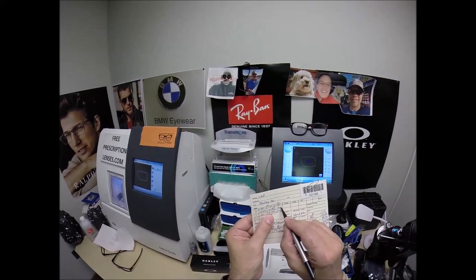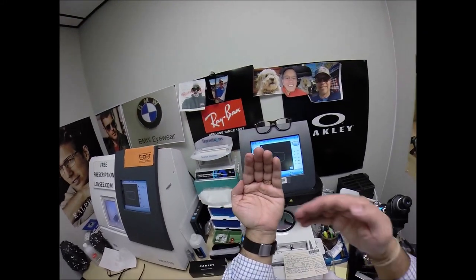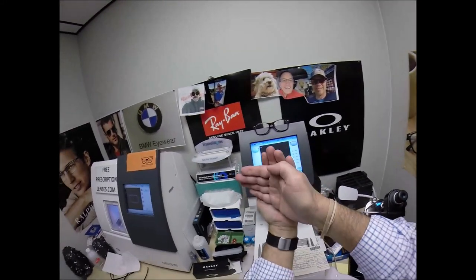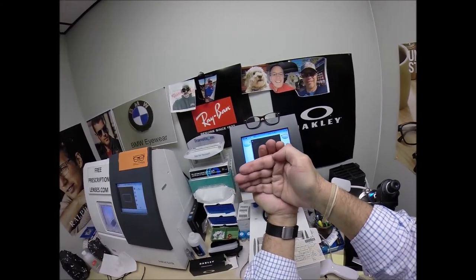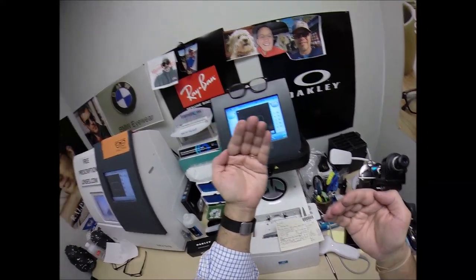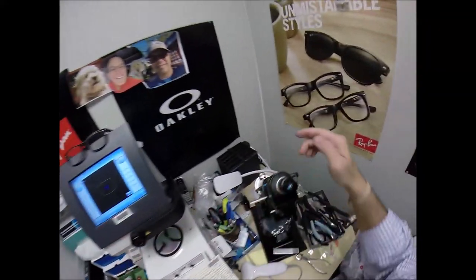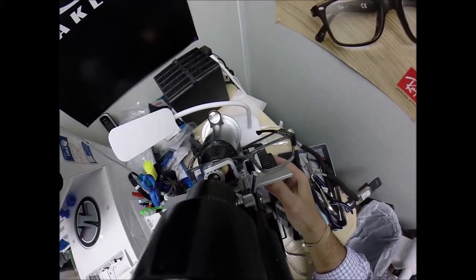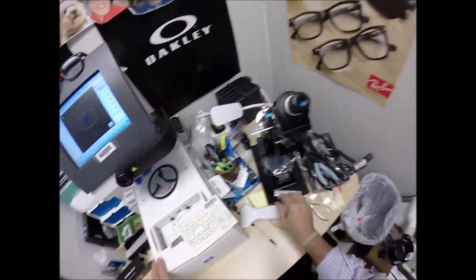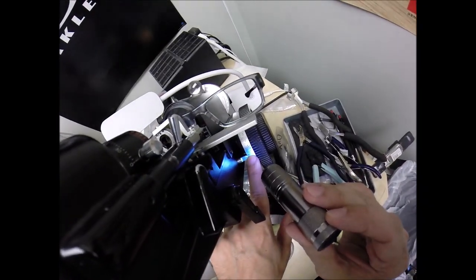We're going to turn that fine-tune knob to 130, but let's, you have a curve on your eye this way, minus a quarter. You have an additional two steps steeper this way, 90 degrees away. So this quarter is at 40. Your astigmatism 90 degrees away is at 130. So that's why we put the axis wheel at 130. Let's check the power. And I'm getting minus 75 going away from half towards one.